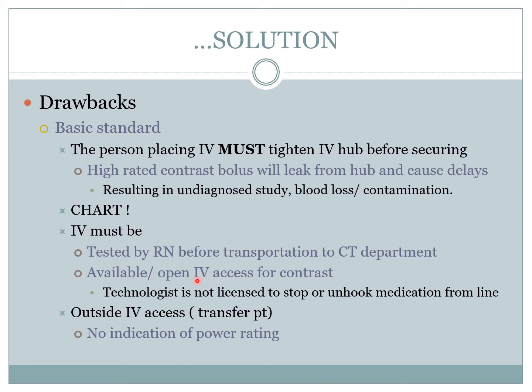So before the patient comes down, it's really good for the nurses to flush the IV just once, to make sure it's still working, because sometimes it's been sitting there, the patient moves, eats, walks around, and they haven't been using it. So it could come out, and you may have given them medication in the morning, but somehow it just stopped working in the middle of the day.